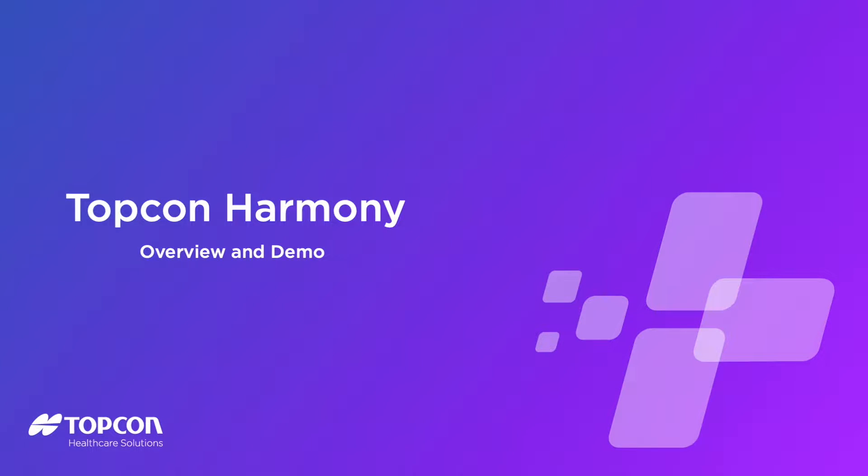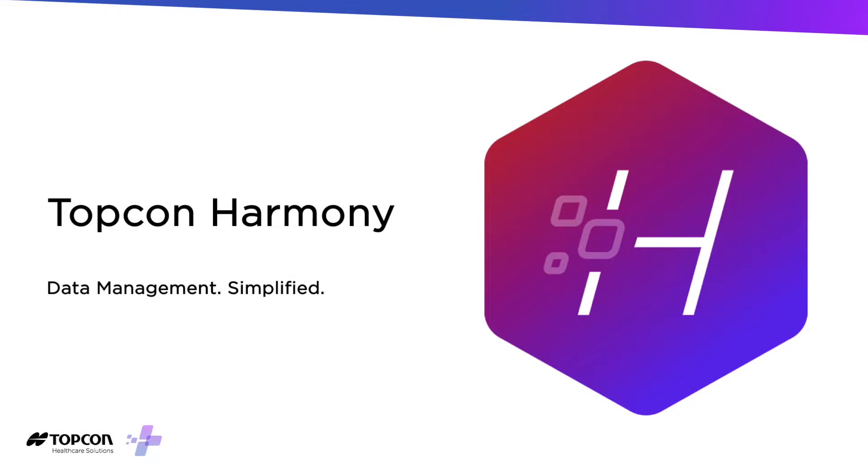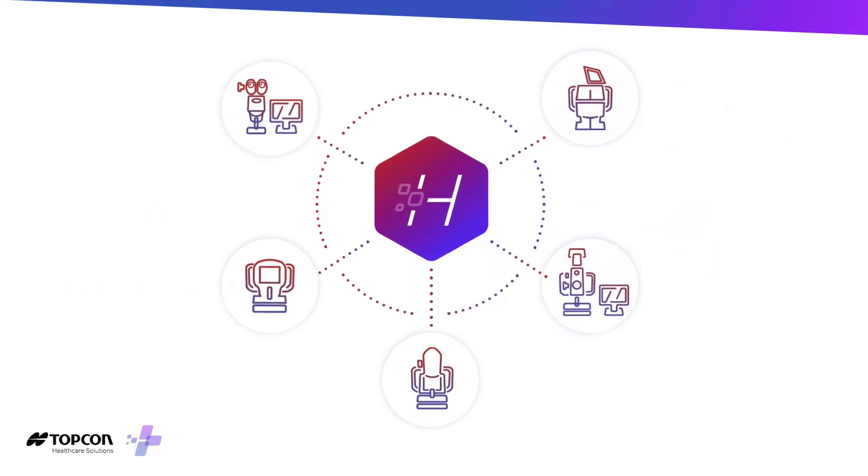Harmony is an all-new data management solution by Topcon. With its new responsive design, streamlined interface, seamless EMR integration, you now have access to every device in your practice, regardless of the manufacturer, all in a single interface.